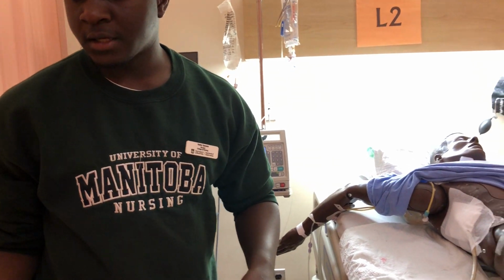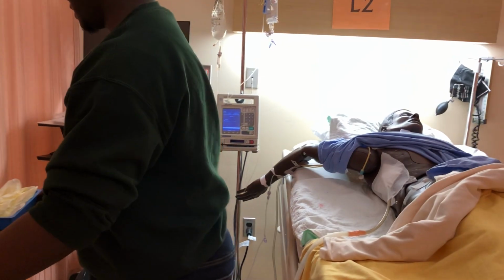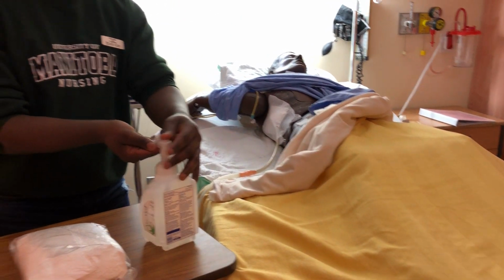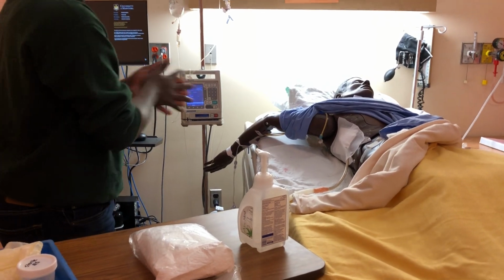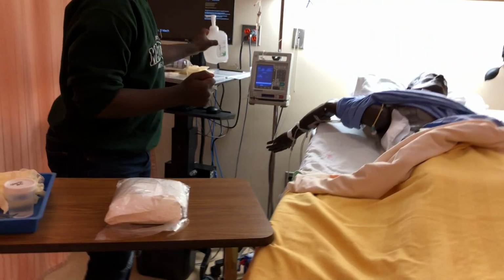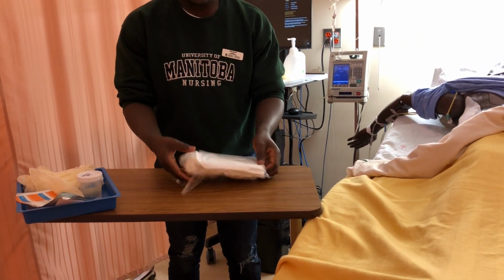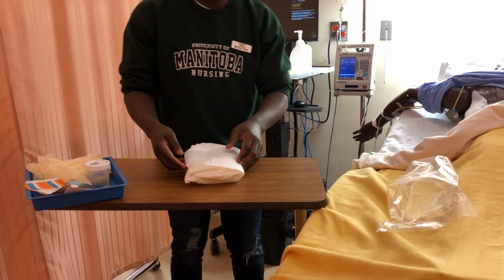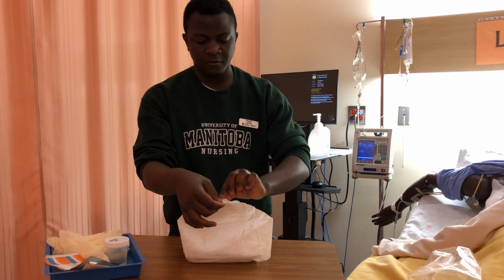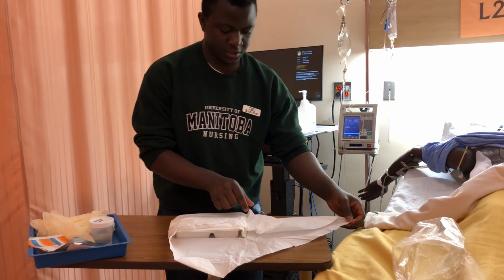As I continue, I will then prep my sterile field for my dressing change. So I'll wash my hands again. I will wear gloves during this procedure. I would wear a mask during this procedure, but because I don't have one, I won't wear it. I'm just going to do a general preparation of my tray before I open the patient's dressing.